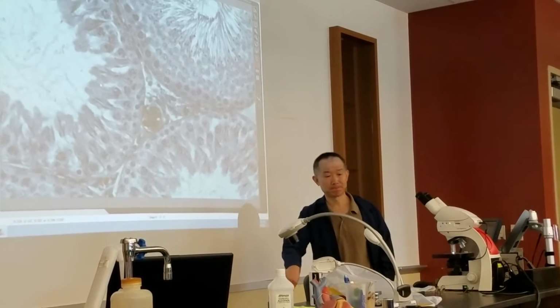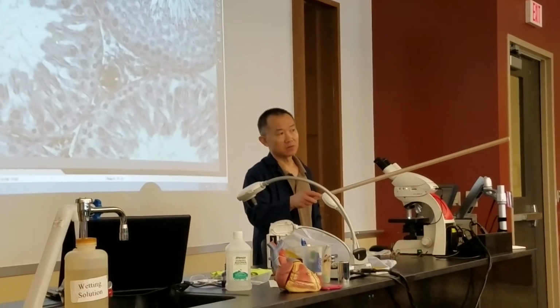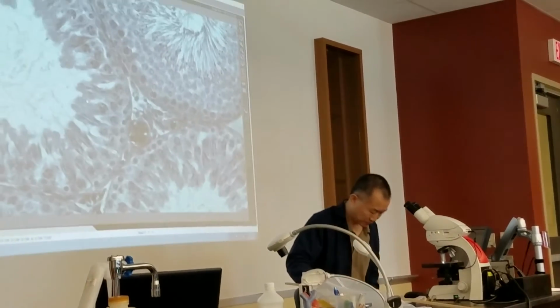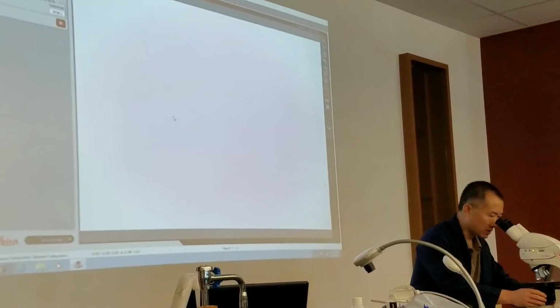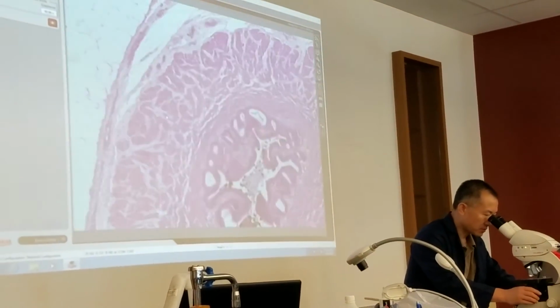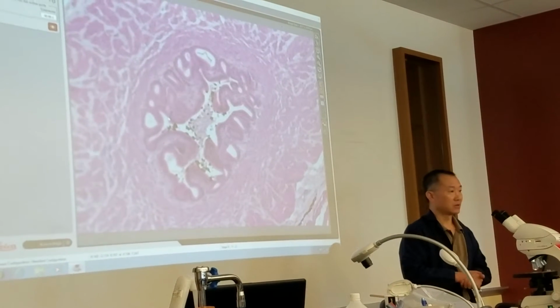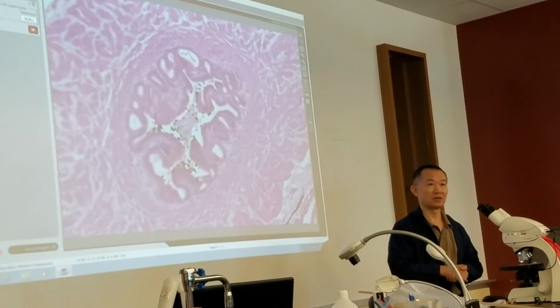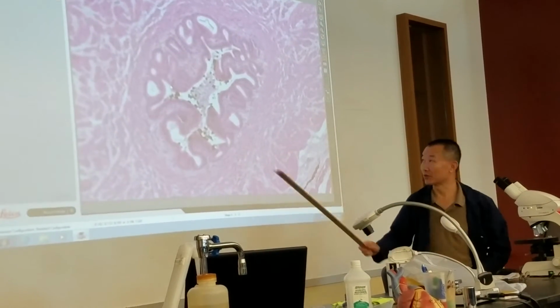Any question? What's your question? All right. Spermatic cord, the only thing I'm going to test you on is this. That's the vas deferens. The whole thing around it is the spermatic cord. So this thing is the vas deferens.